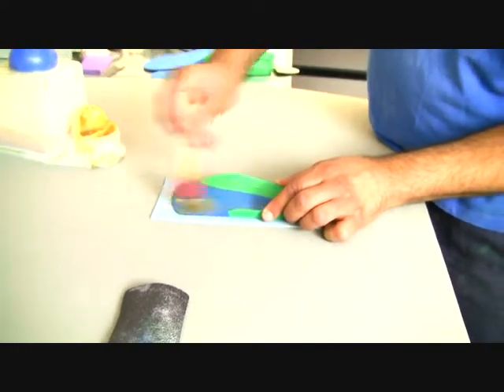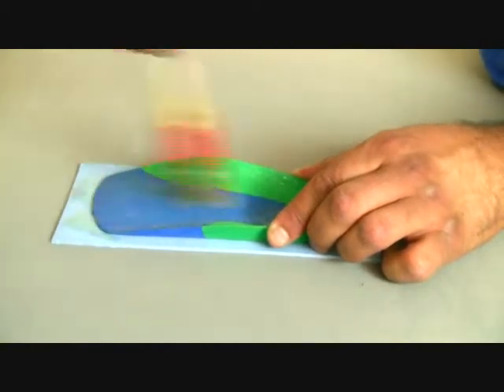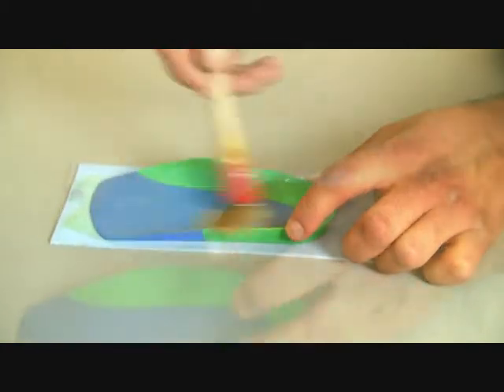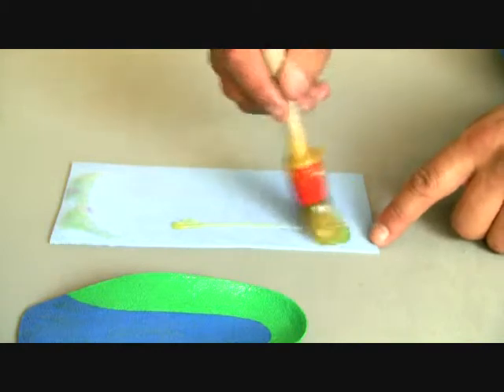Position the orthotic on the soft PPT cover. We're using double abraded material. Apply the glue to the dorsal surface of the ICB orthotic. Make sure that it's fully applied and that you've got plenty of glue going into the heel cup area.